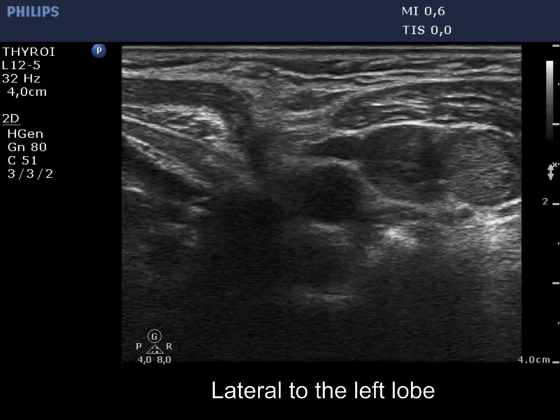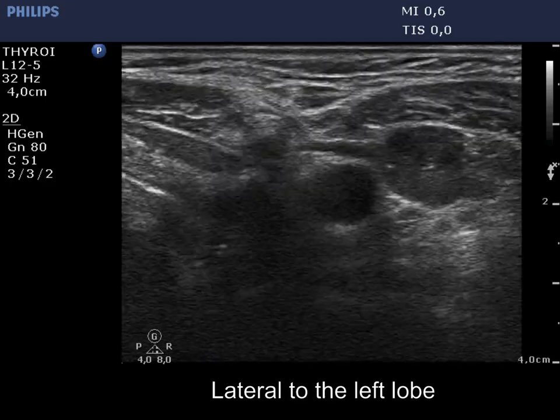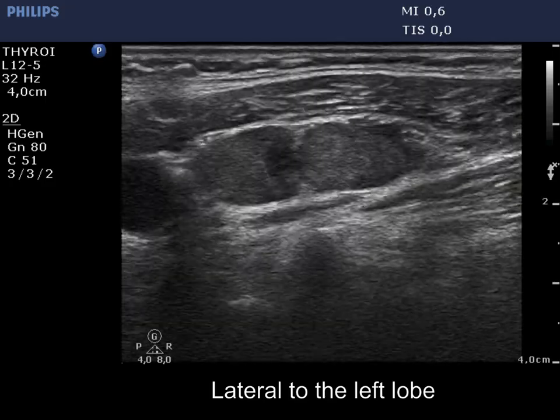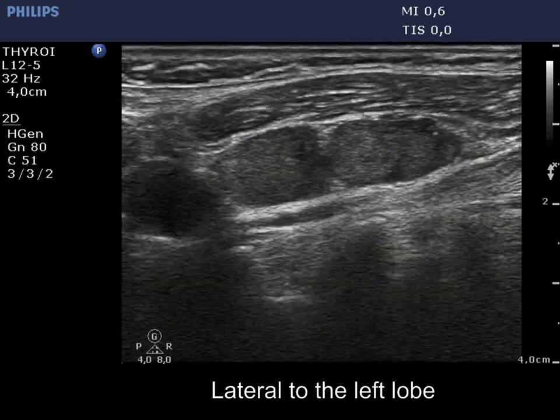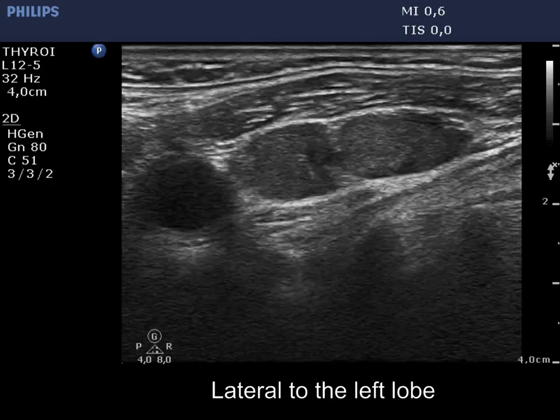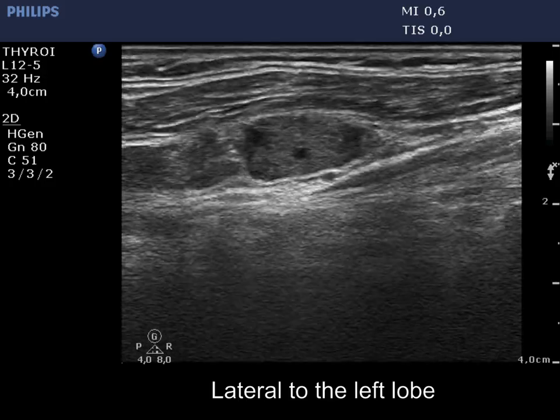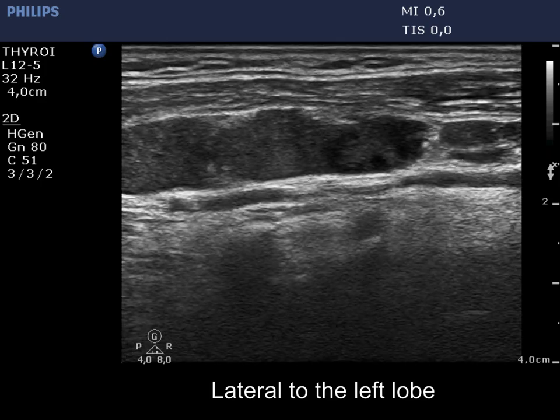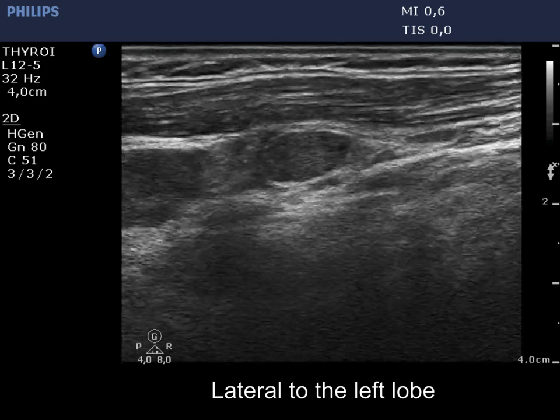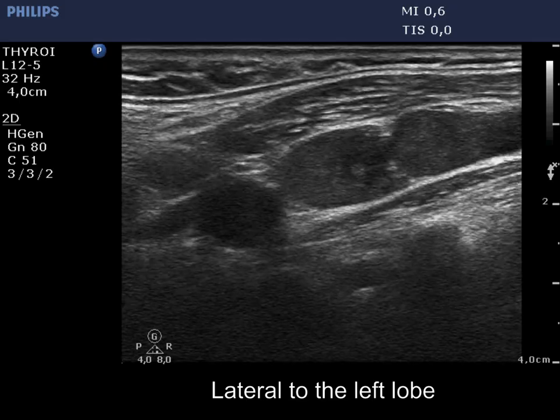Now in the video, a chain of atypical suspicious lymph nodes are presented. These have less hyperechoic solid parts, microcalcifications, and lack a regular hilum. Note the tiny cystic areas within.